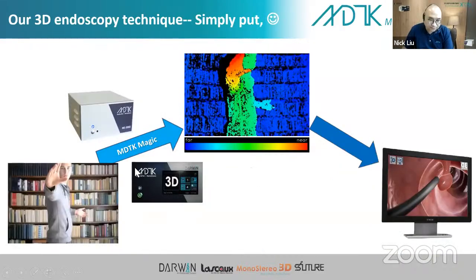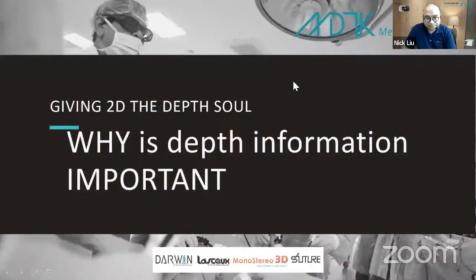The concept of the depth map is easy. It's like this handsome man here. He is standing, and his hand is very close to the endoscope, the camera, okay? So you can see in the depth map that it is red, because it's very close to the camera. Like my hand now is very close to the camera. So in the Monostereo or in the Darwin, that would be in red color. And then we process the video, the image, like this. The far away bookshelf would be in blue color.